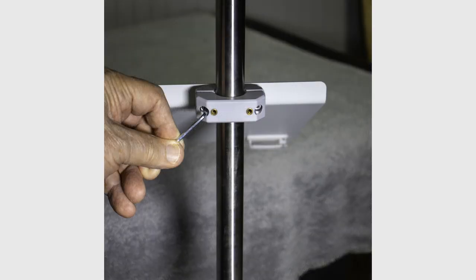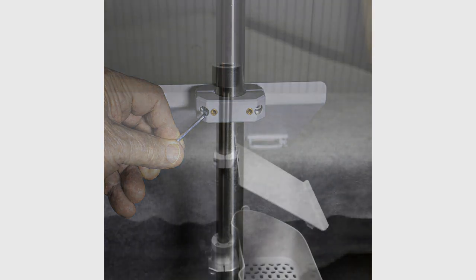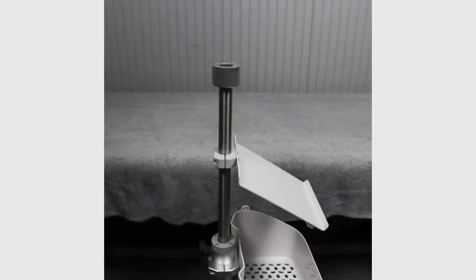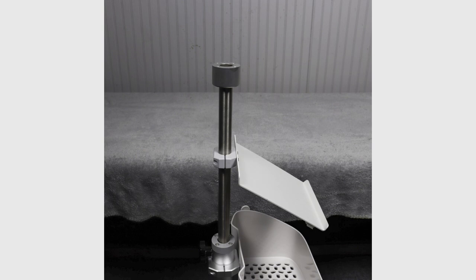Using the smaller Allen wrench, loosen the cufflink tray so it can be moved along the shaft. Lower the cufflink tray about 5 inches from the top of the shaft and then re-tighten.